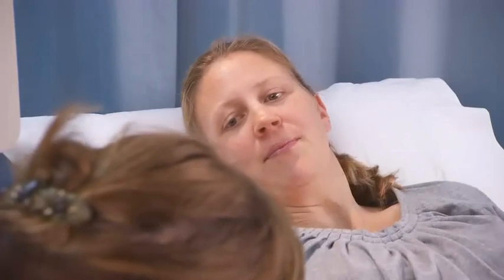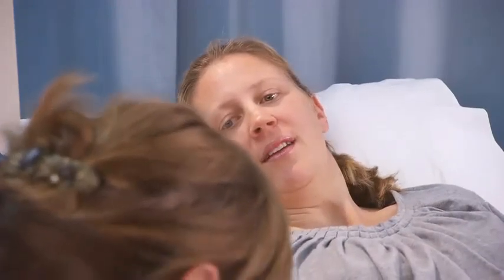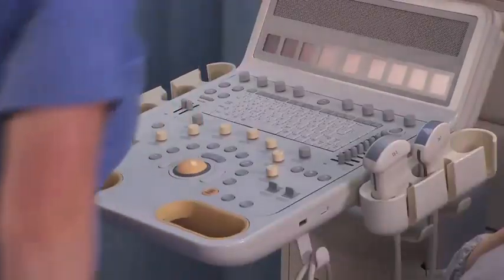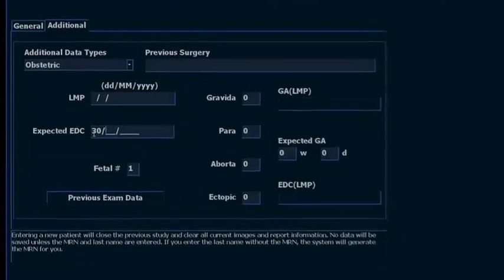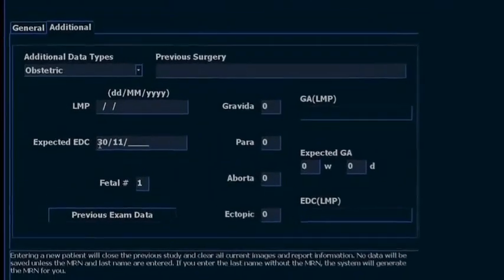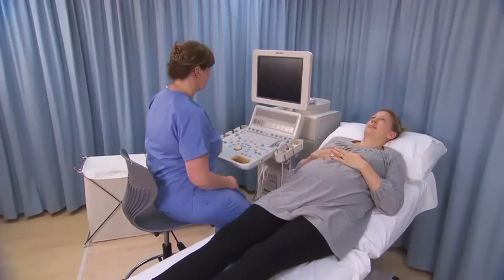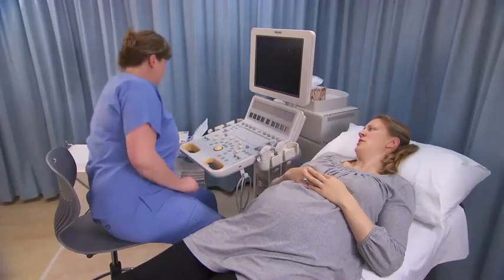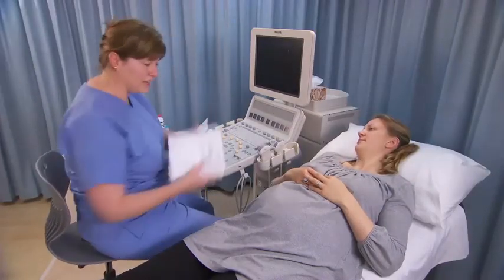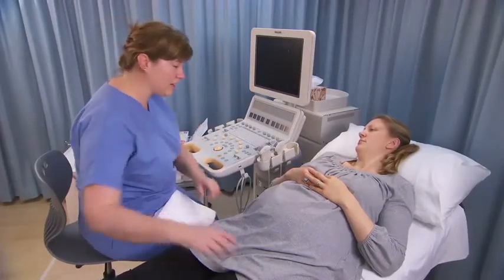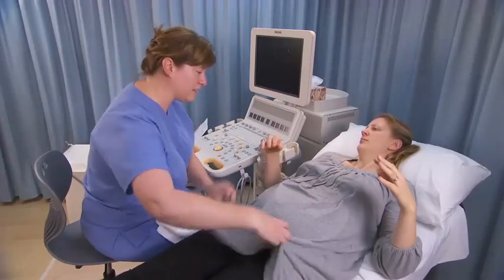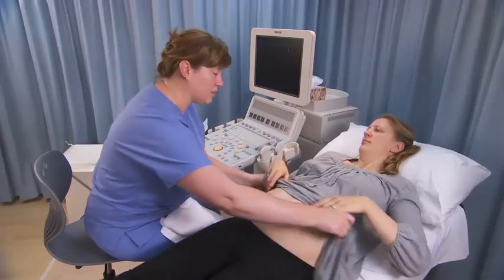Enter the patient details and last normal menstrual period or estimated dated delivery into the ultrasound machine. Sit or stand next to the patient's right side with the ultrasound machine to the left upper end of the examination table, or the opposite side if you are left-handed.